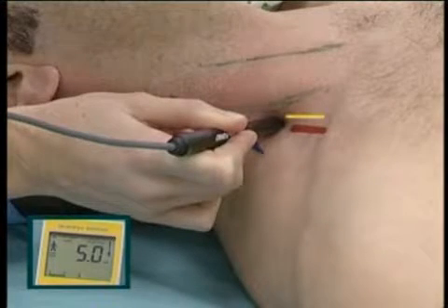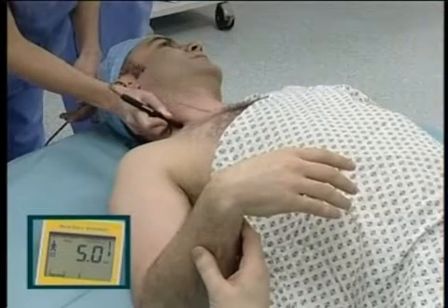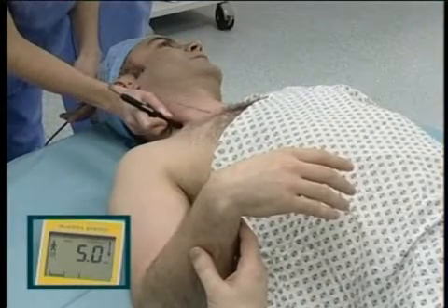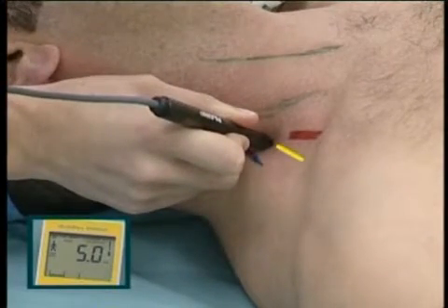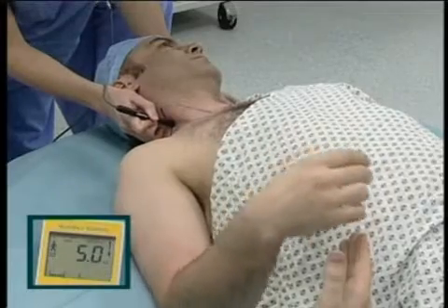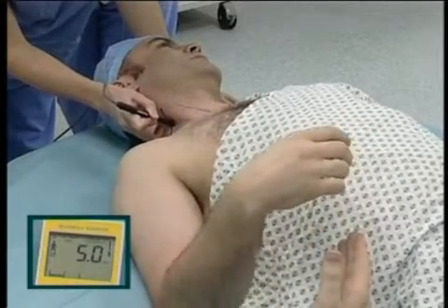Next, we stimulate the phrenic nerve, which is anterior to the brachial plexus. We can see diaphragmatic contraction. Moving laterally into the interscalene groove, we stimulate the brachial plexus, and one can see forearm flexion as the median nerve is stimulated.